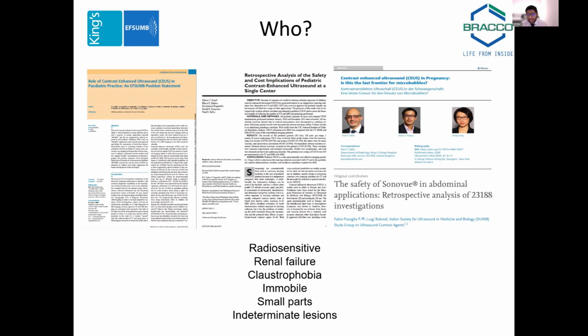The patients that we need to be aware of who will benefit most from contrast enhanced ultrasound are those that are radiosensitive, the pediatric patients, again, as in pediatric traumas. Those patients with renal failure, there's no nephro or hepatotoxicity. You do not need to check bloods beforehand. And in my hospital, certainly that's a problem. Often we get patients without eGFRs being sent to CT. So it's something that certainly saves you on those occasions.